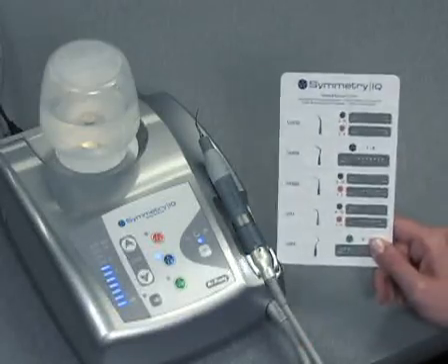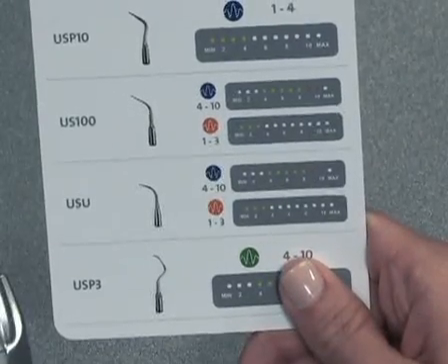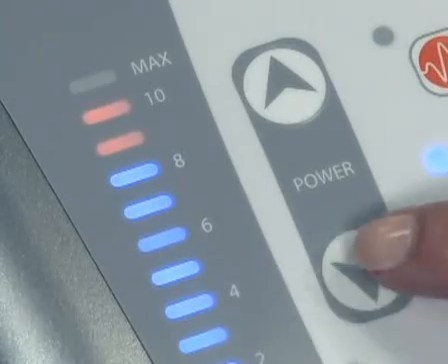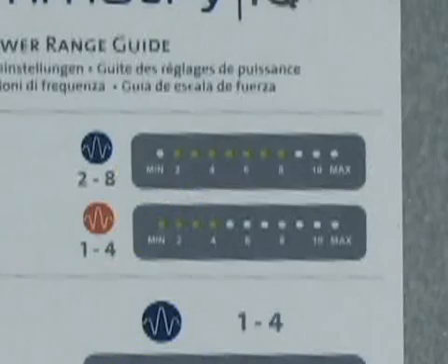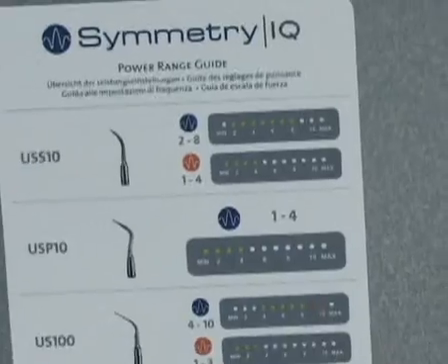As certain tips have power recommendations that span two power modes — for example, blue and orange mode — please refer to the power range guide for all appropriate power settings. Set the recommended power level with the power arrows on the front panel. The light in the power display panel will indicate the selected power level. Confirm that the power level is set in the appropriate range for the selected Symmetry tip.